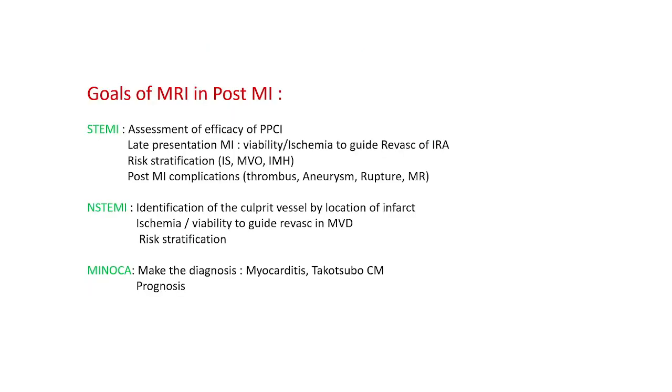So the goals of MRI in post-MI patients, particularly STEMI, are to assess the efficacy of primary PCI by looking at the salvageable myocardium, and in those who are late presenters, the issue of viability or ischemia to guide revascularization, and also risk stratification and detection of other complications.